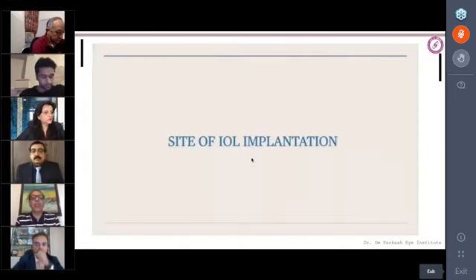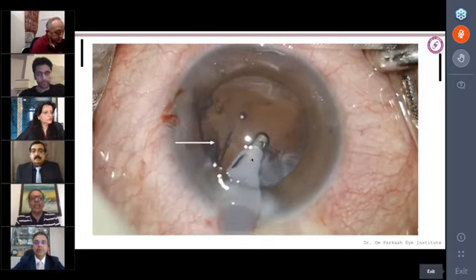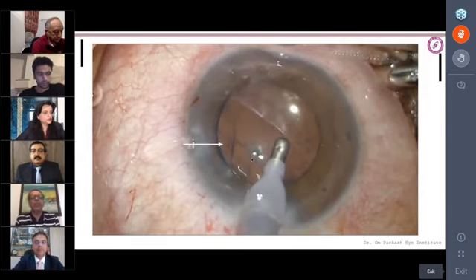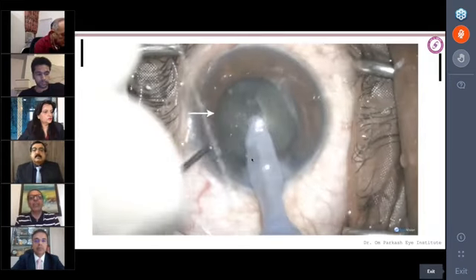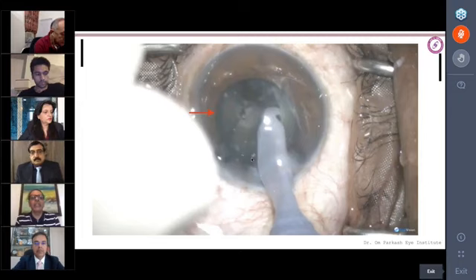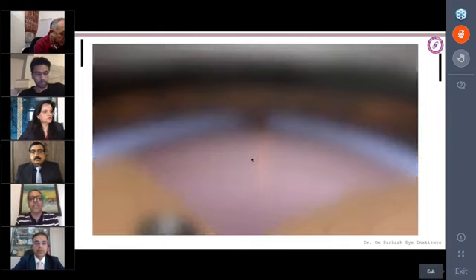The surgeon continues. So we can know the site of IOL implantation in these intumescent cataracts with Argentinian flag sign. With fluttering, you can put an intraocular lens in the bag. The end point of safe phacoemulsification we can also know in these cataracts. The moment it stops fluttering, that is the end point, and that is because this appears much before the classical signs of posterior capsule rupture.